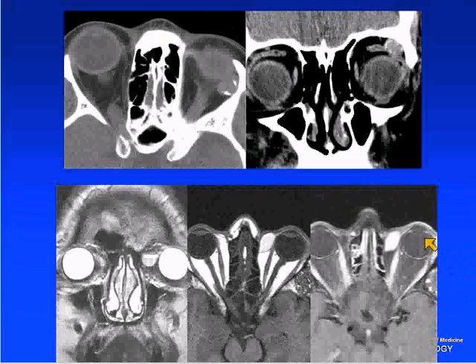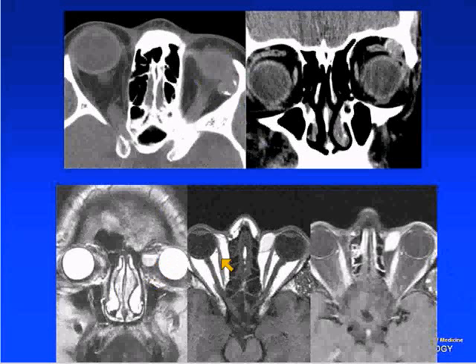This is a typical dermoid. They typically occur in the superolateral region of the orbit. They can calcify and have bony scalloping, typically at the frontozygomatic region. On MR, they may have fluid-fat levels and are typically hyperintense on T1-weighted images. It's important to remember they can occur in non-typical locations within the orbital region, including the medial canthal or medial portion.